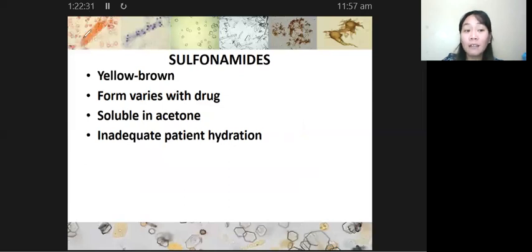Next, we have your iatrogenic compounds, or your medications. So, take note class na usually kasi, kaya nagka-crystallize yung ating mga medications or iatrogenic compounds, this is due to inadequate patient hydration. So kung kunwari man na well-hydrated naman yung patients, walang problema. Hindi magka-crystallize yung ating iatrogenic substances. So usually, nagka-crystallize lang sila kung hindi umiinom ng tama ng tubig yung pasyente natin, wala siyang proper hydration.